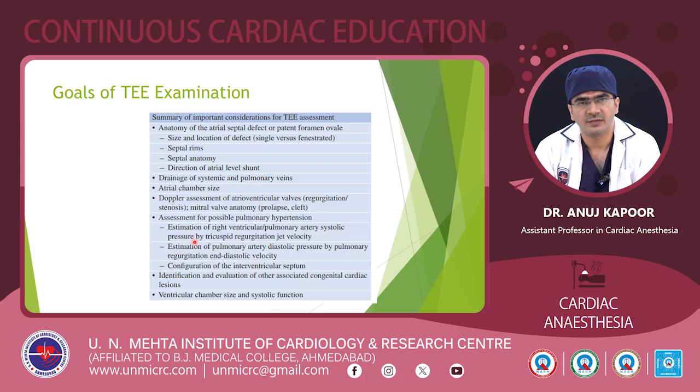Through the TR jet, we can get the systolic pressures of the pulmonary artery, and the diastolic pressure by pulmonary regurgitation and diastolic velocity. This will help us to assess the pulmonary artery pressure status and whether we can progress towards the closure of this defect. And we'll also have to assess the configuration of the interventricular septum.